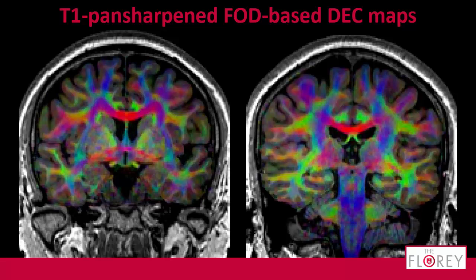And nice delineations everywhere just because of the T1. It's the T1 you're looking at, just with some quite clever painting on it. So that's quite handy, because our interpretation stays the T1. It's not confusing at all.